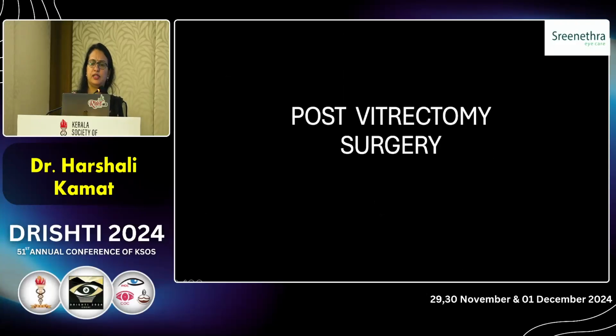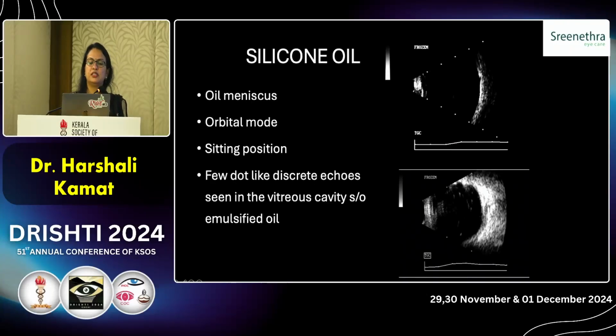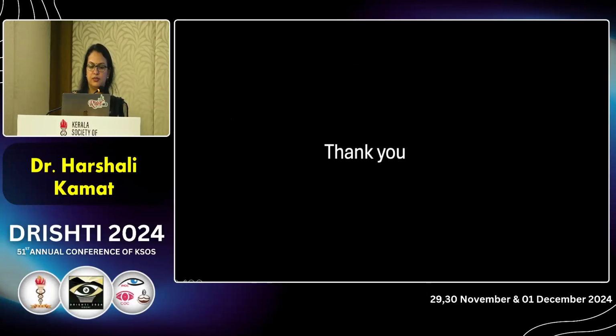Sometimes, post-vitrectomy surgery, you have a mature cataract and you see certain features like an apparently enlarged globe with the oil meniscus, it's an oil-filled eye. Post-SOR, you may find discrete echoes in the mid-vitreous cavity.